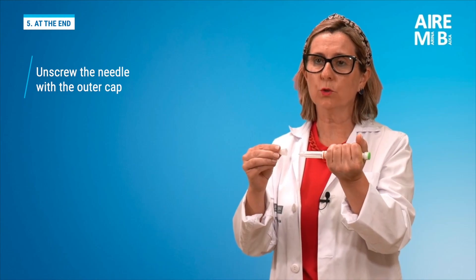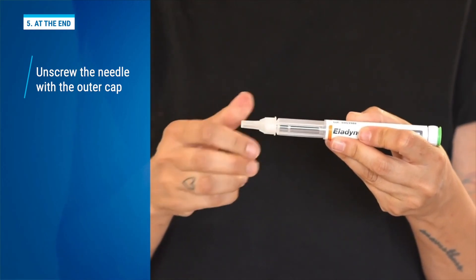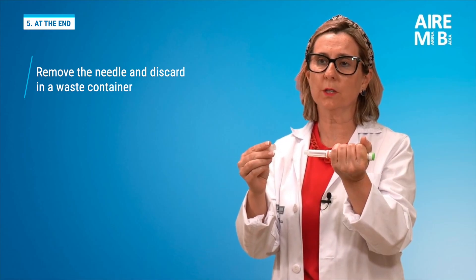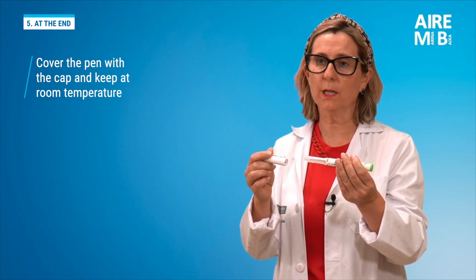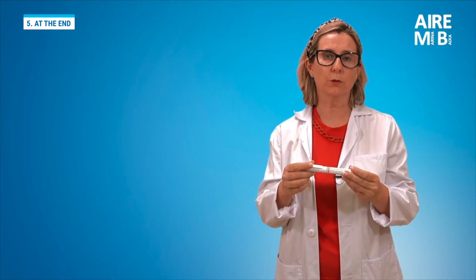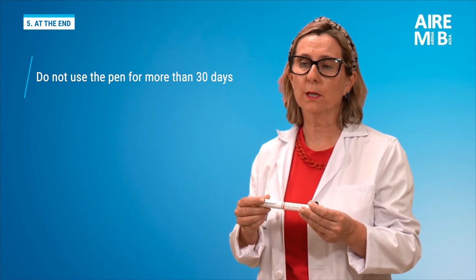We carefully unscrew the needle by gently reinserting the outer cap and turning it approximately eight times counterclockwise. We carefully remove the needle with the outer cap and dispose of it safely in a waste container. We cover the pen again with the cap and keep it at room temperature. The pen contains medication for 30 days plus a small amount to test the pen the first time. We should not use the pen for more than 30 days.